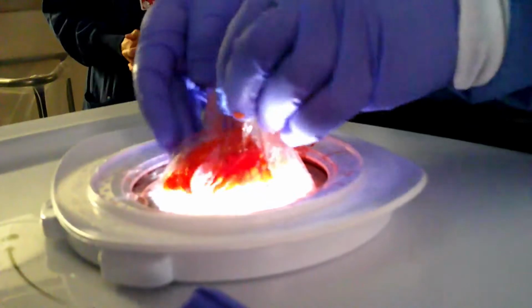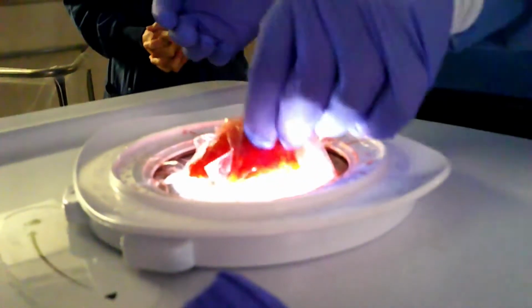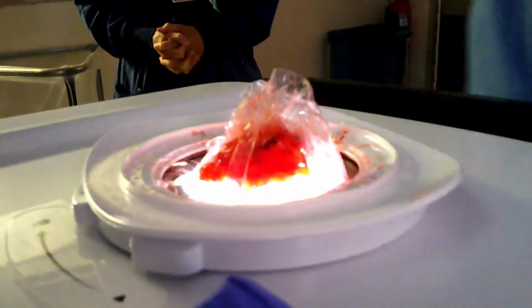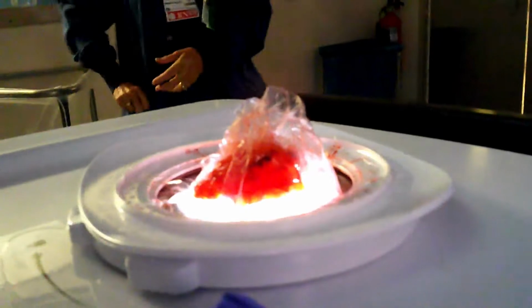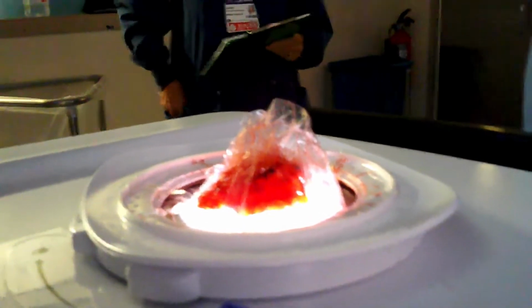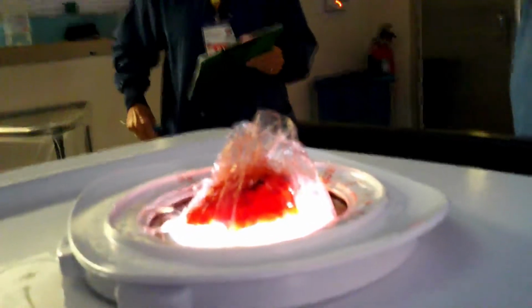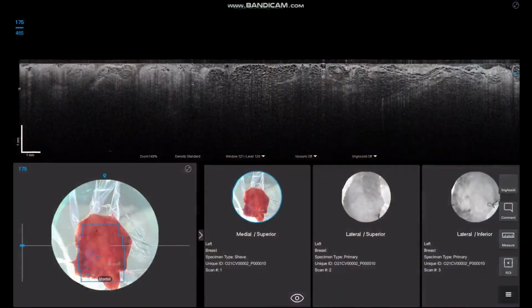When I'm finishing the lumpectomy, I give the specimen with the silk sutures to my nurse and place it in the Faxitron, and get an image intraoperatively so I know that I have my markers, so that I can look grossly to see if there's any calcifications near the margin. And at that point, I am able to begin the scanning process.